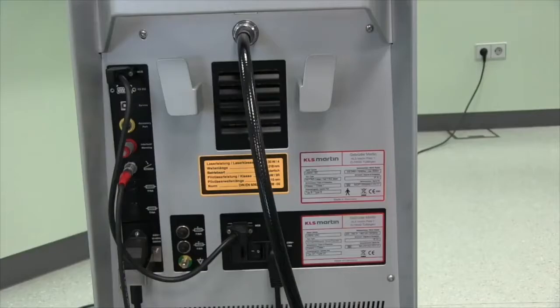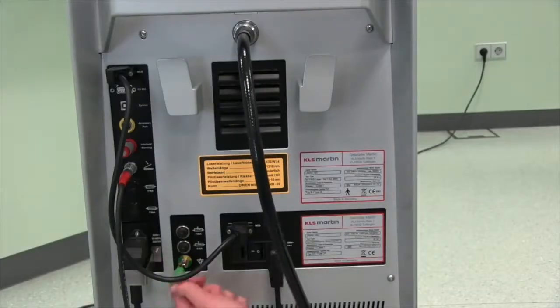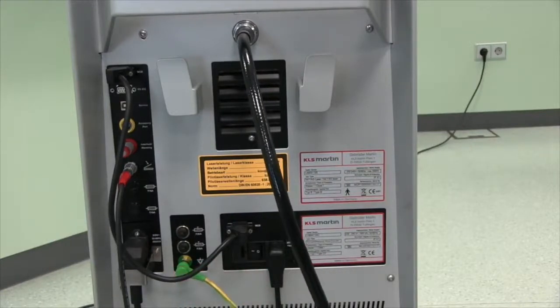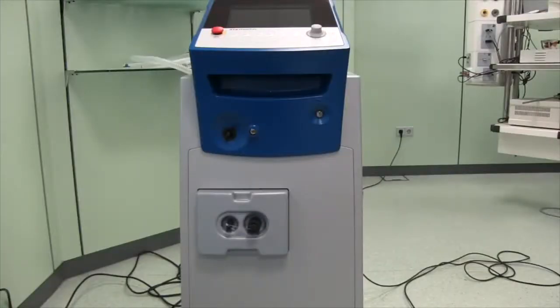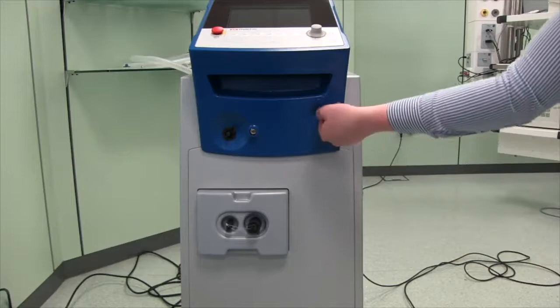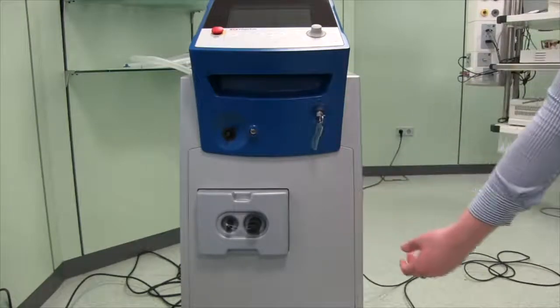Optionally, the potential equalization cable can be connected to the laser and additionally to the potential equalization system in the operating theater. Let's turn to the front side of the Limax 120 laser device. Switch on the laser by turning the key clockwise.